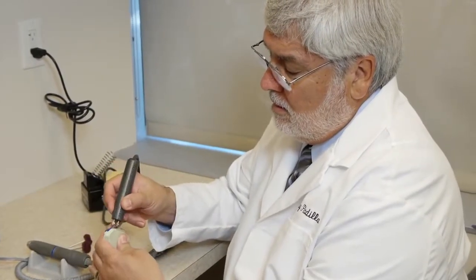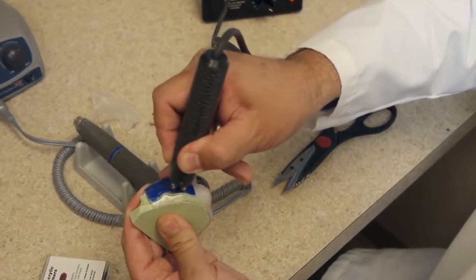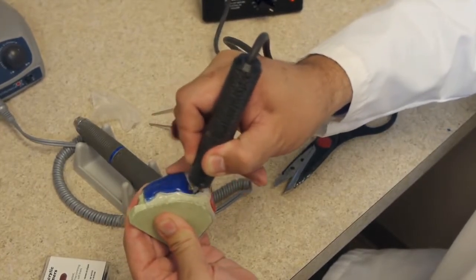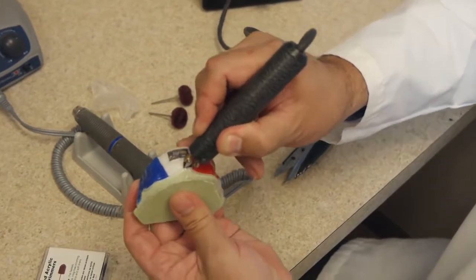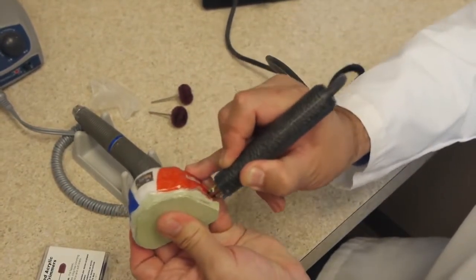And then again, keeping the high vestibular border. The higher up you can trim this without causing a sore spot, the more retention you're going to have.